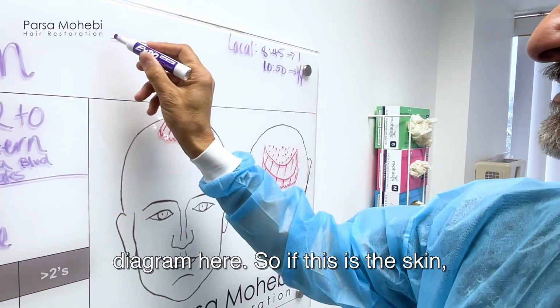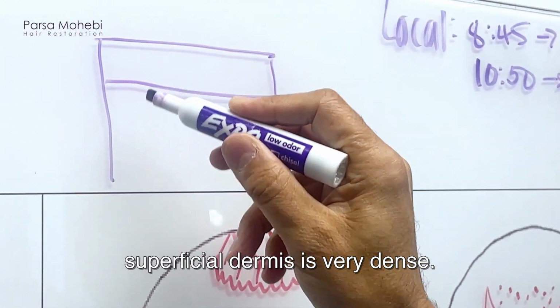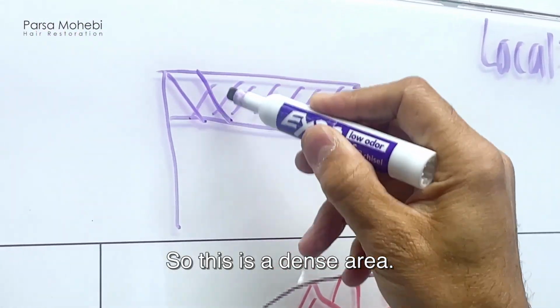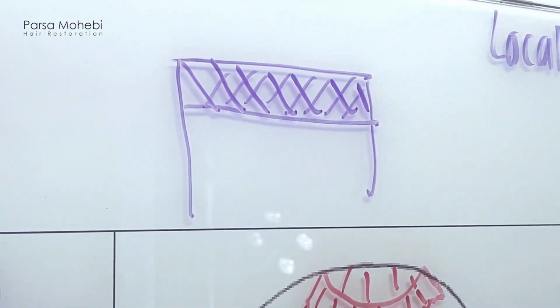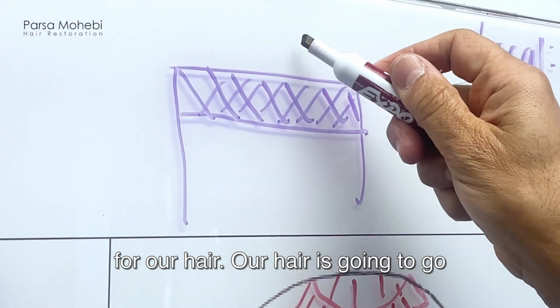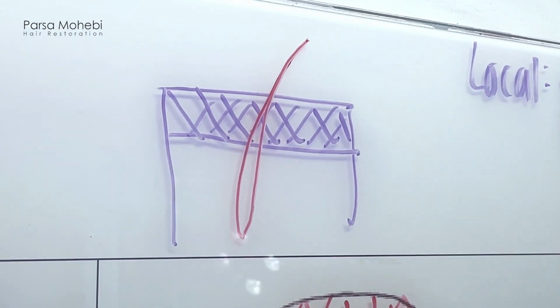So let's look at the diagram here. If this is the skin, the superficial layer, epidermal and superficial dermis, is very dense. So this is the dense area, okay? And let's use a red color for our hair. Our hair is going to go like this. This is the hair follicle that we want to extract.